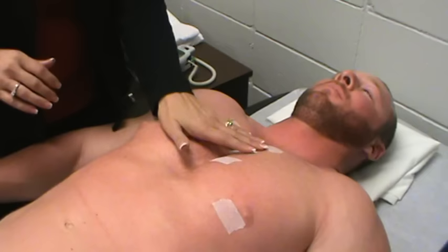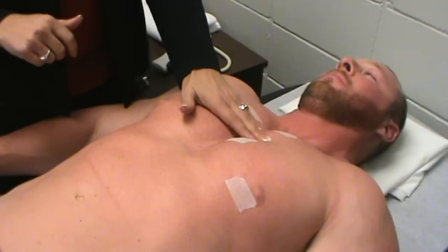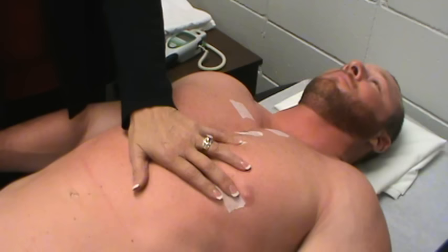Okay. Now, when I listen to your aortic and your pulmonic, I'm going to hear the second sound of your heart, which would be the S2. It's going to be louder than S1. When I listen to Erb's point, they're going to be equal. S1 will equal S2. And then when I listen to the tricuspid and the mitral, the first sound, which is the S1, is going to be louder than the S2.